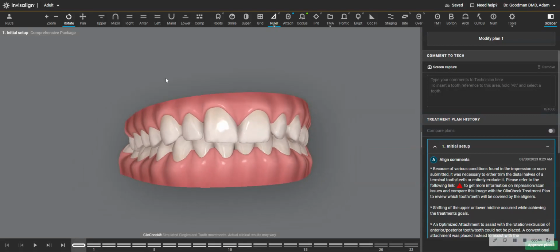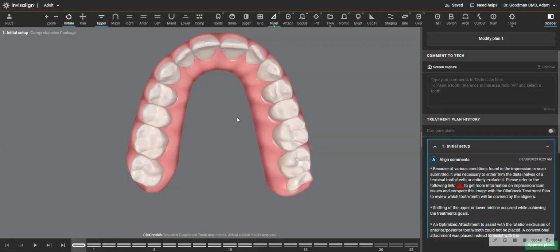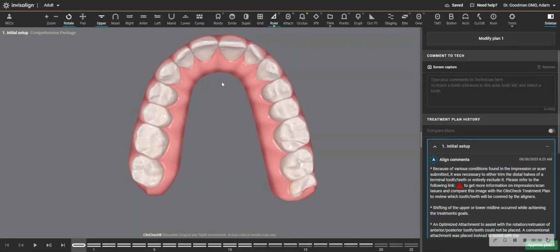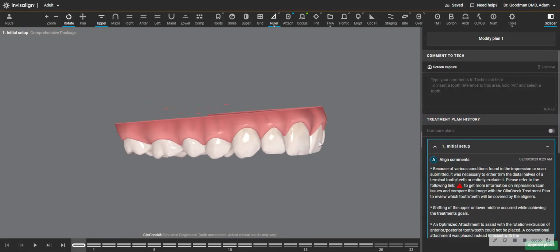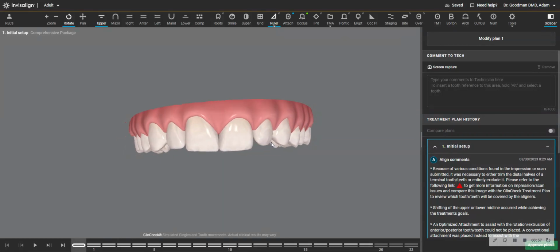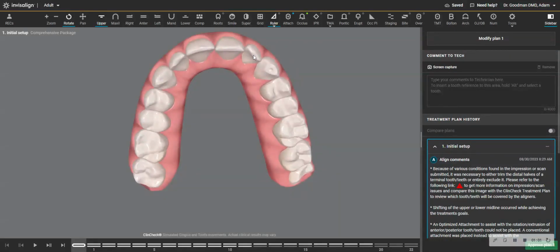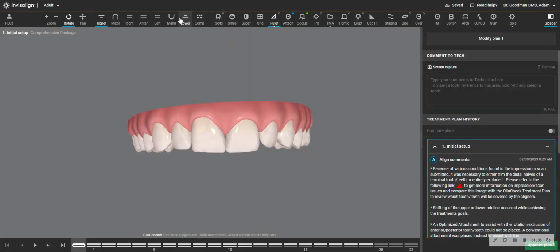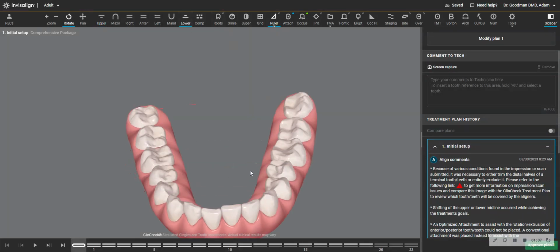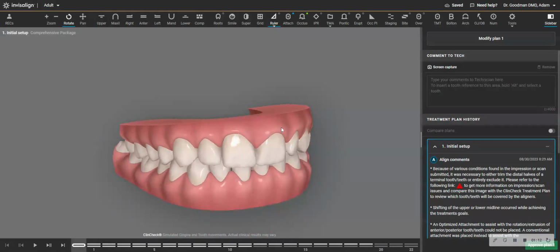Now, I recognize, because I look at teeth on a computer and in real life every day for 30 years, that she doesn't have a lot of crowding. And so any forward movement of her teeth would lead to spacing beyond at least just a little bit of broadening to align. But at a certain point, you're going to start opening up spaces, and that might limit you. Same on the lower. So you can maybe expect a moderate forward movement of these teeth.